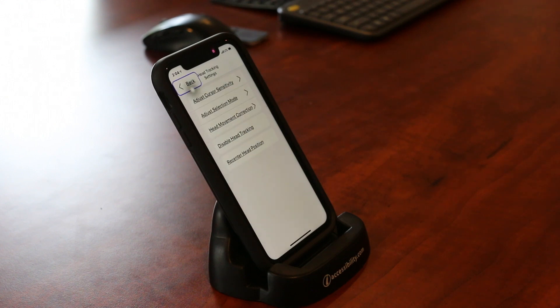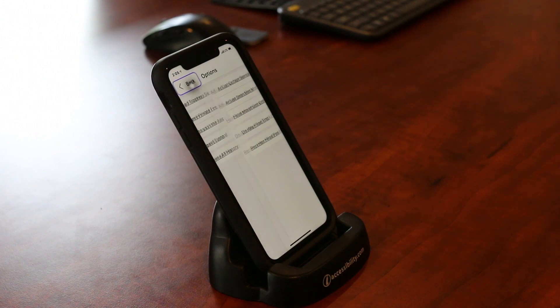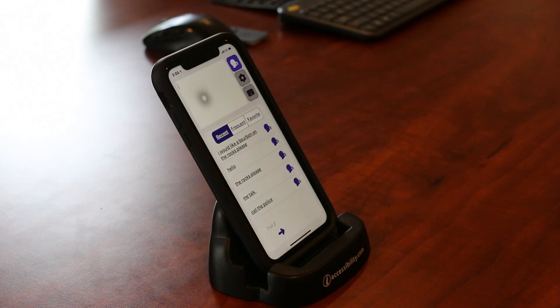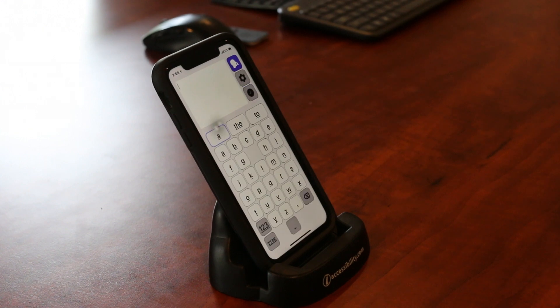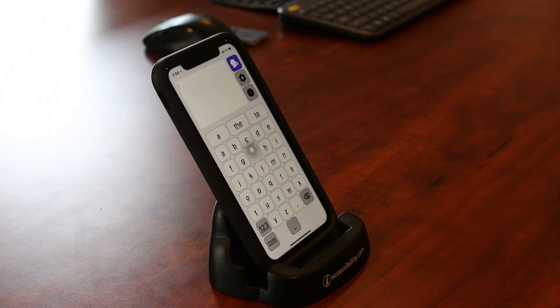I can also change some other things if I want to. I can change my head movement. And if it does get out of calibration — I'm going to get back to the very beginning — if it gets out of calibration, all I have to do is just shake my head like I'm saying no, and I can recalibrate the whole thing.